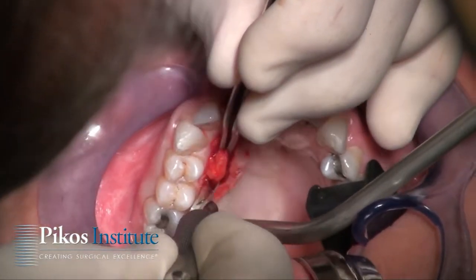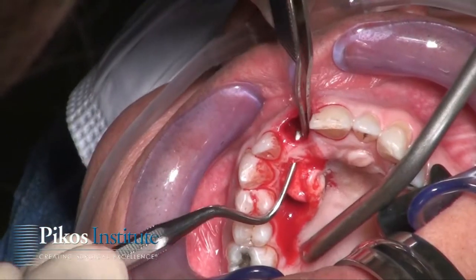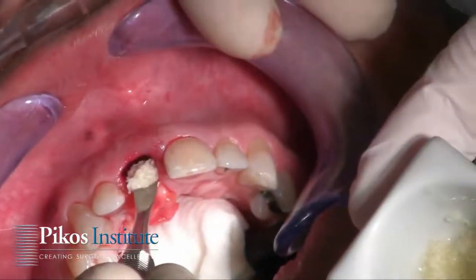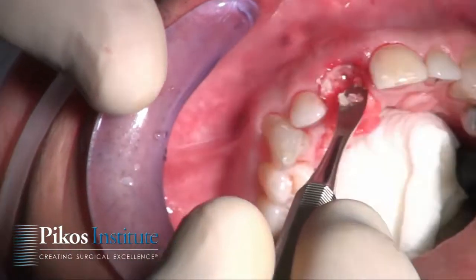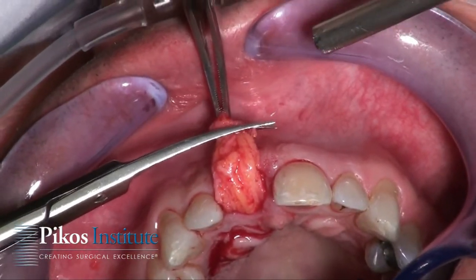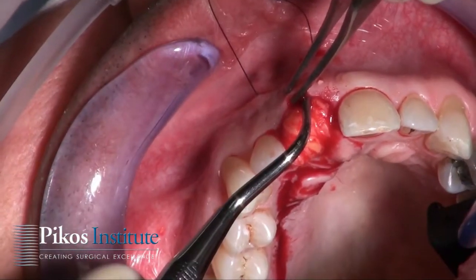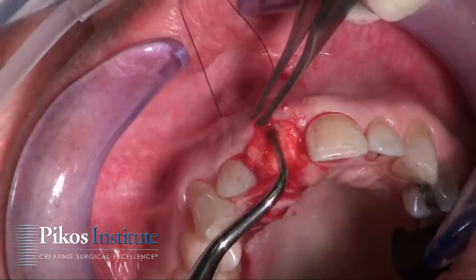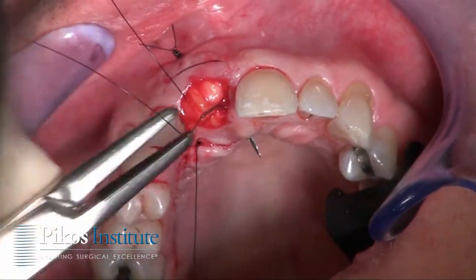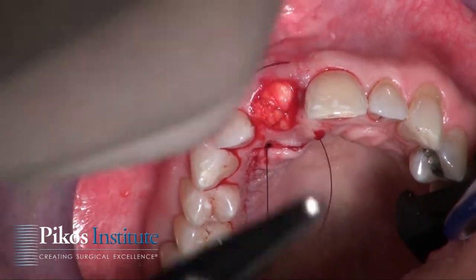We did that incision to the palate. There's the deep one, the distal, and now it's freed up to where I can feed it under the tunnel. There's my Mineross that's been soaked in Gem 21 — I'm just trimming the end of this. And now I'm going to come in with my FS2 needle, nylon 5-0. Now I continue to place the CTG within the pouch. There's my horizontal mattress and off and running.